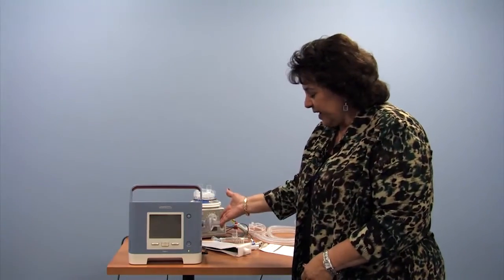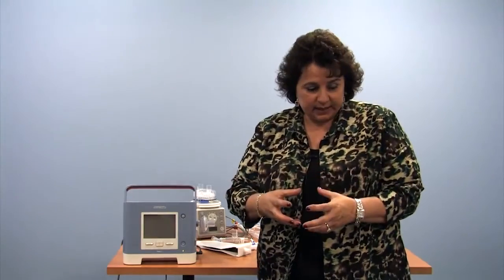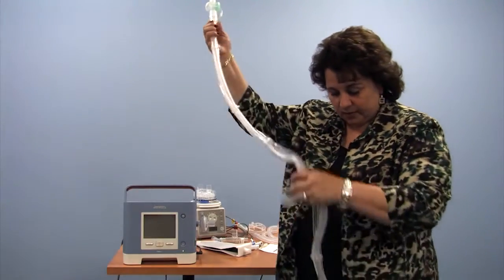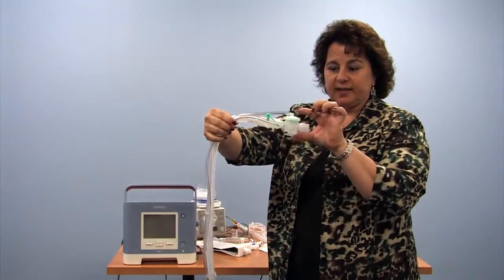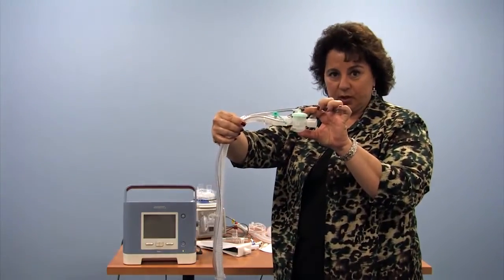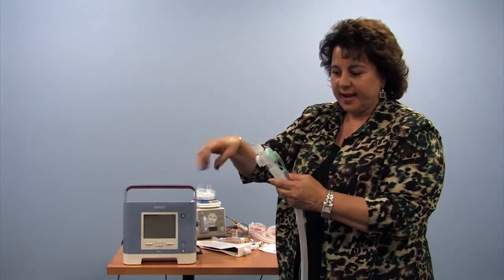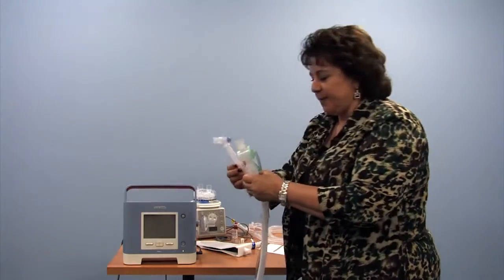So here we would attach our tubing. For the active circuit, which has an exhalation valve in it, this would be primarily used for a tracheostomy patient, but not necessarily. We have the circuit here, which has an exhalation valve in it, which will open and close between the breath cycles. The patient gets attached to here with a form of adapter.